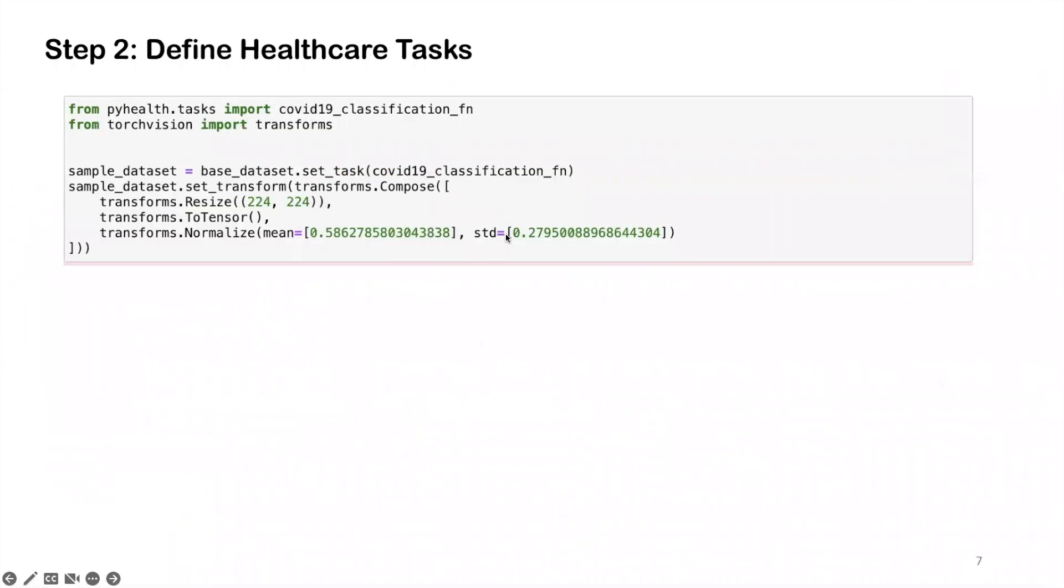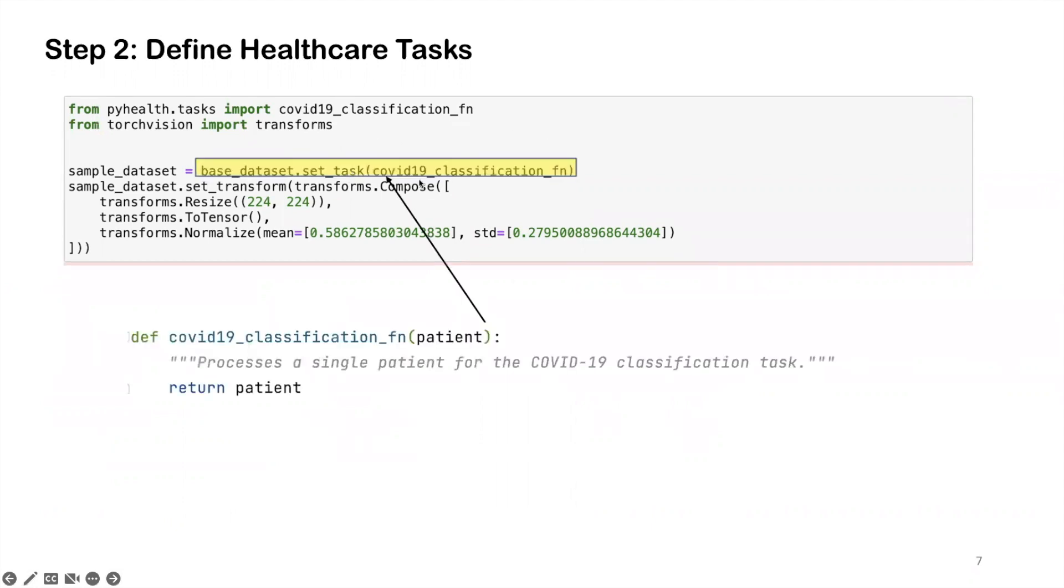In the second step, we're going to define some healthcare task using this specific dataset. This is done exactly as the EHR clinical prediction modeling by calling this set task function. Here, we set a task to be this COVID-19 classification function. And inside the function, it's actually very simple. Right now, we didn't do anything. We just returned the original patient we got.